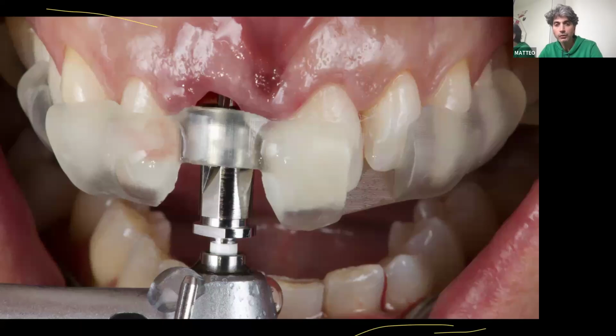It's very important to use first the short drills and to drill little by little. If not, you can have a very high grip between the sleeve and the drill, you know. So you cannot go directly with long drills, even if you have some engagement of the tube part of the drill, of the apical part of the drill.